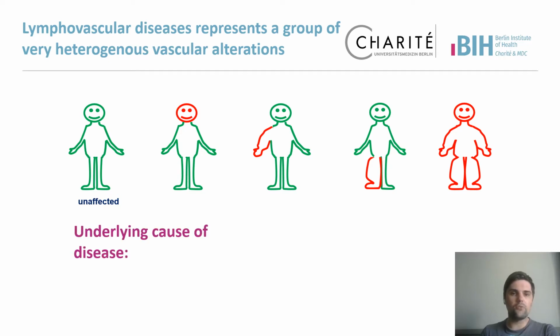If we now want to identify the underlying cause of the disease, we can of course perform genetic testing to elucidate the genetic alterations causing the phenotype. But we can also perform a histological analysis, which I will now focus on.